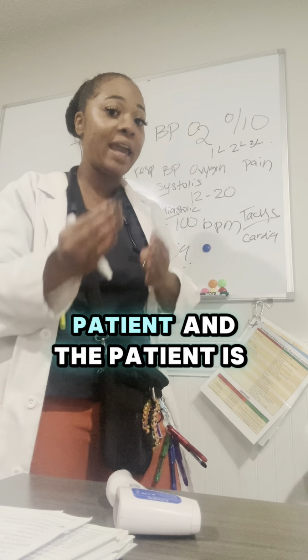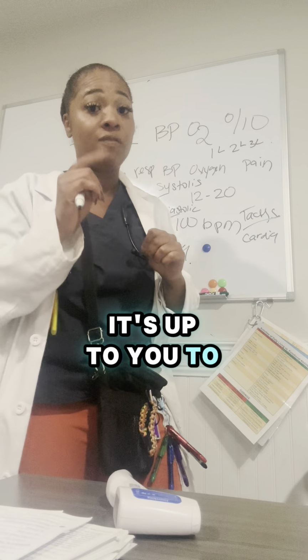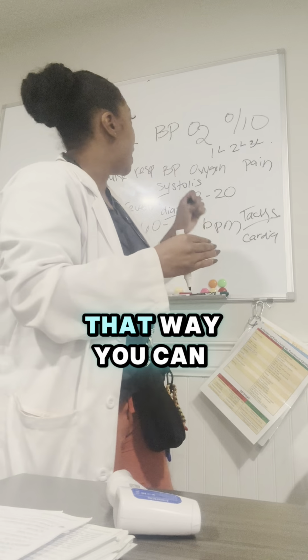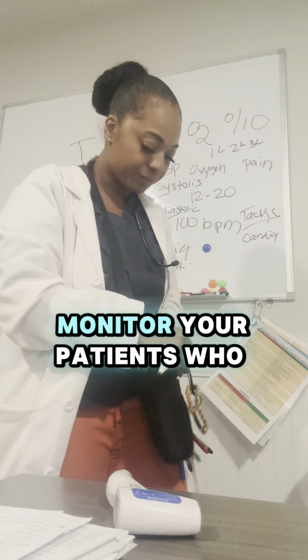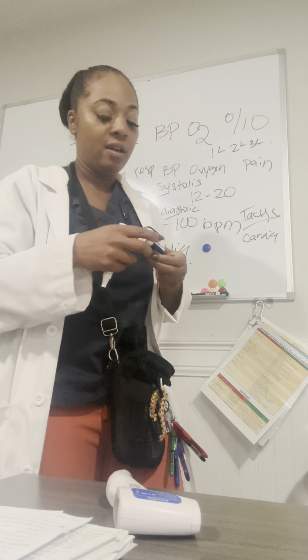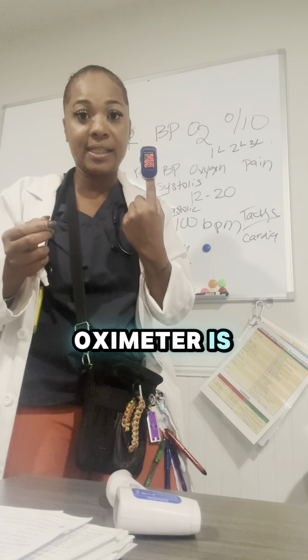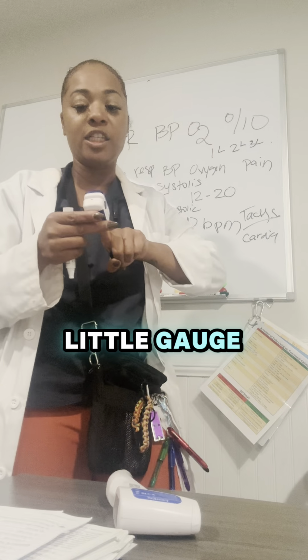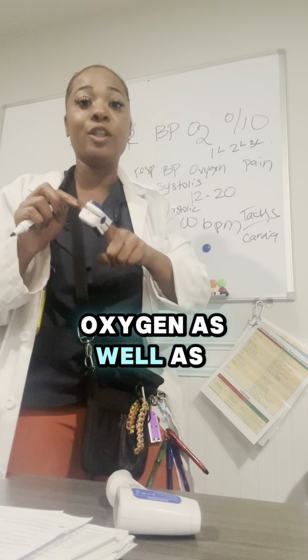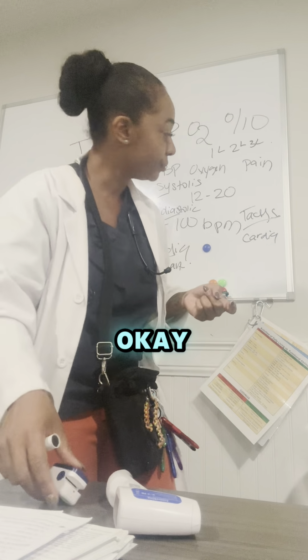If you receive a patient and the patient is on oxygen, it's up to you to verify how much oxygen they are on. That way you can monitor. Your patients who have oxygen, you always want to check and see what their pulse oximeter is. It'll tell you on this little gauge their O2 sats, the oxygenation, as well as their pulse, their heart rate, on this little gadget here, okay?